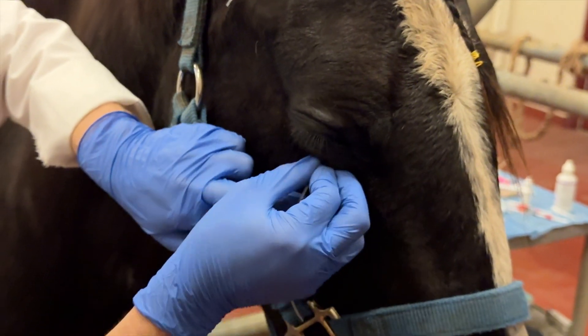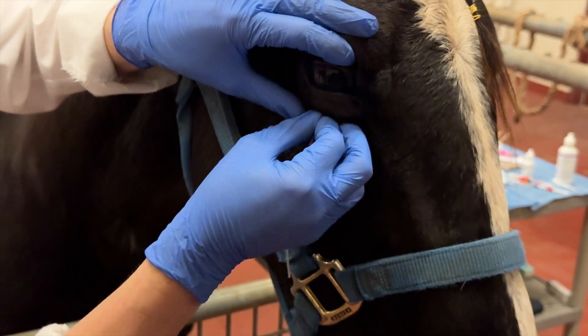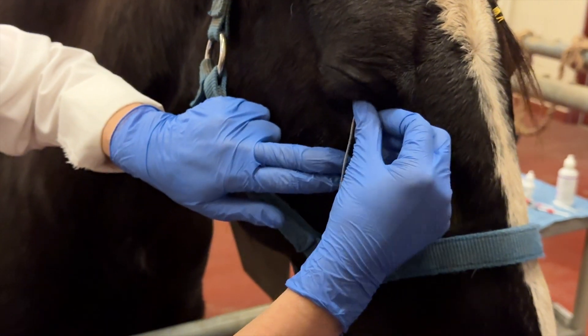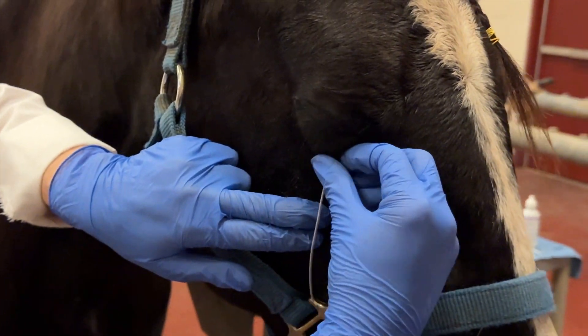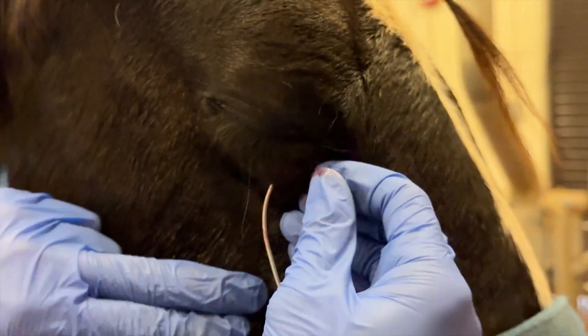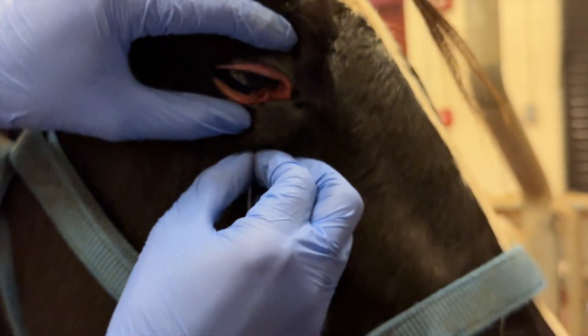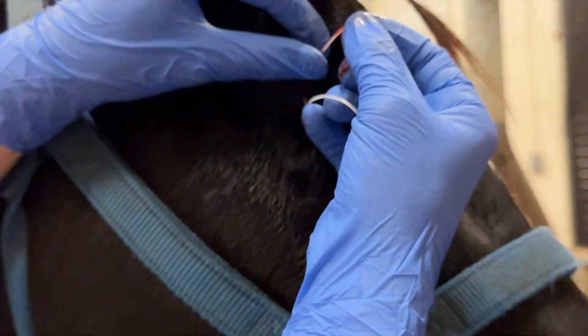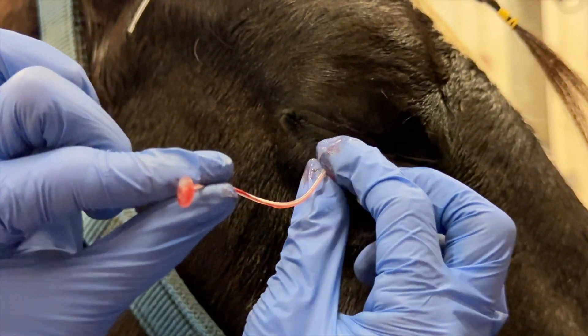You don't want to pull it, as that can break off the footplate into the conjunctival fornix and you'd have to go fishing out for it, which is very difficult. So you push against the eyelid until you start to see the footplate peeking out through the palpebral fissure, and then grab the footplate and pull it out through that direction.